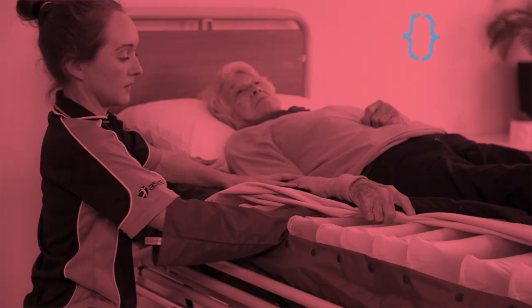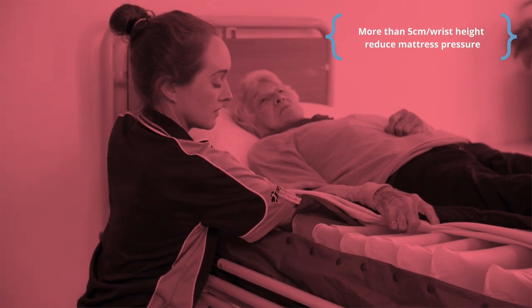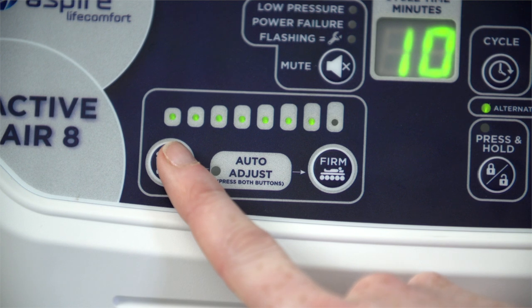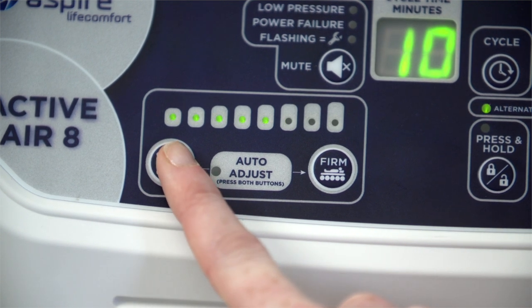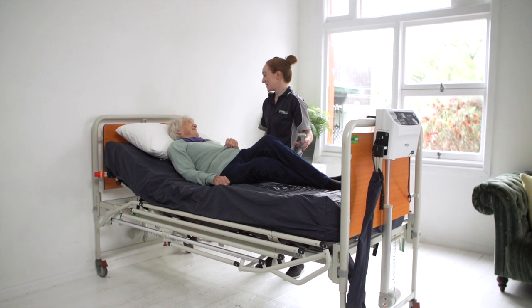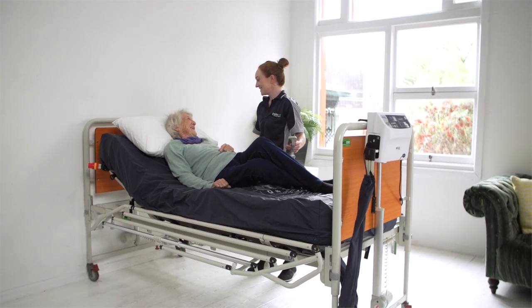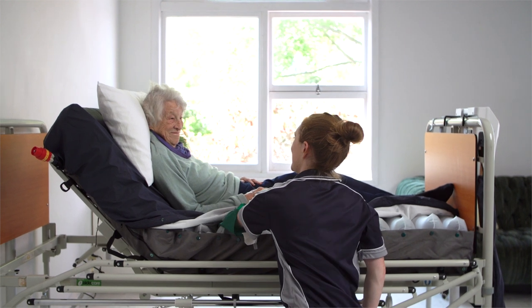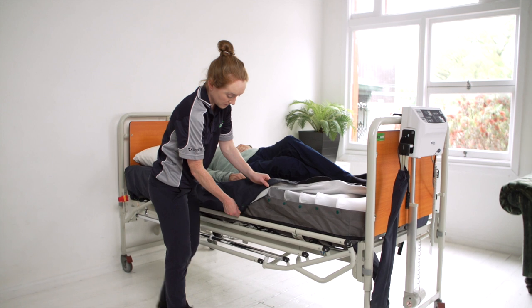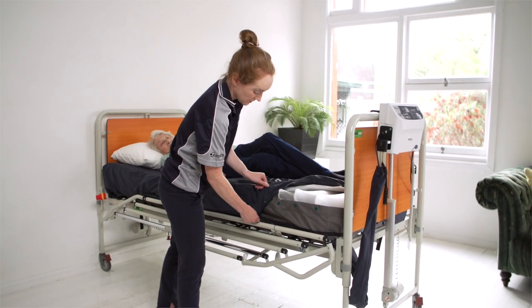If there is more than 5 cm or greater than wrist height clearance, pressure should be reduced. Do this and wait 10 minutes before retesting. When you are satisfied that the user isn't bottoming out in a flat position, also test with the head of the bed raised to a 45 degree angle. Rezip the cover when testing is complete.